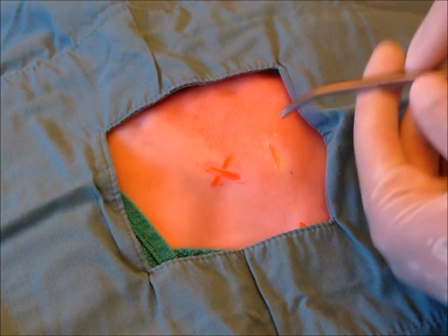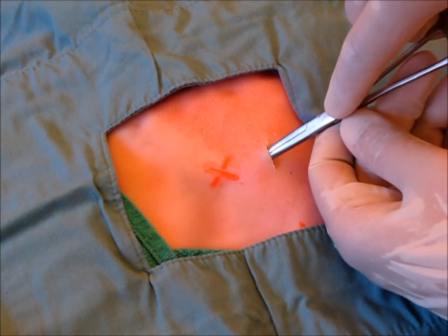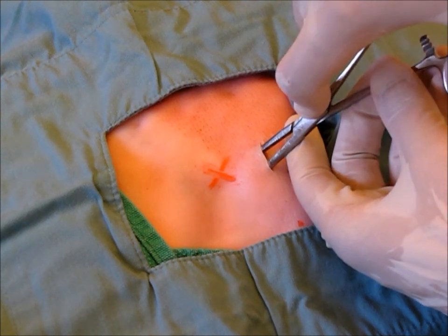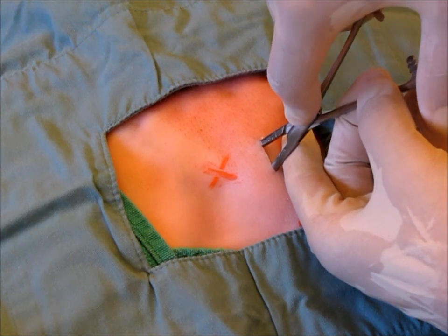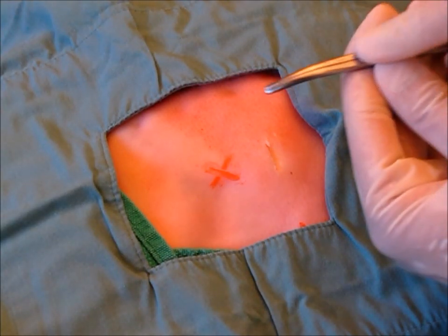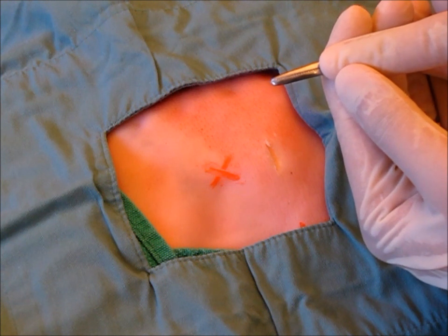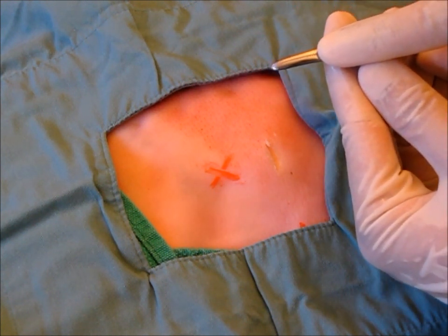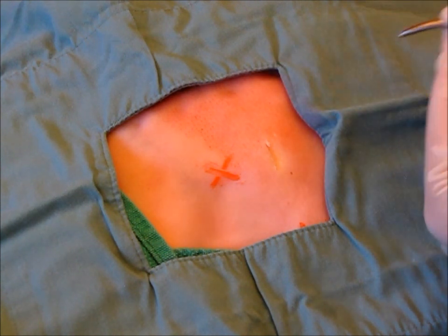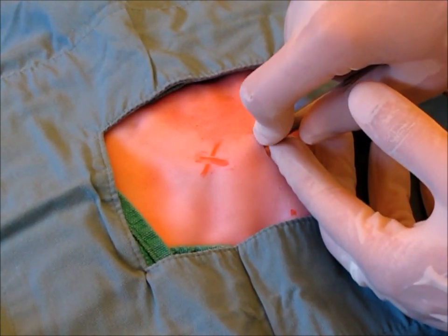Again, using the kelly, advance it using a two-handed technique towards the intercostal muscles, taking care to avoid the neurovascular bundle on the inferior aspect of the superior rib. Once the intercostal muscles are reached, you may spread the kelly, thereby opening up the intercostal muscles and exposing the pleura. Again, with the kelly clamp closed, advance the kelly using a two-handed technique, keeping your index finger approximately two centimeters from the tip of the kelly clamp. This step is essential, as when you puncture the pleura, it prevents the kelly from thrusting into the thoracic cavity, while avoiding the neurovascular bundle on the inferior aspect of the superior rib.